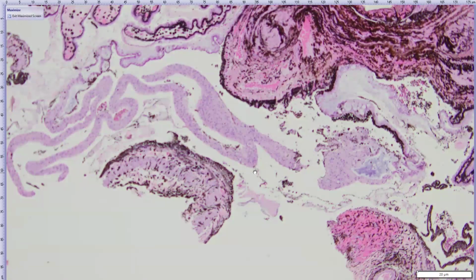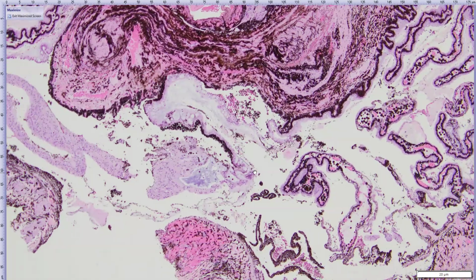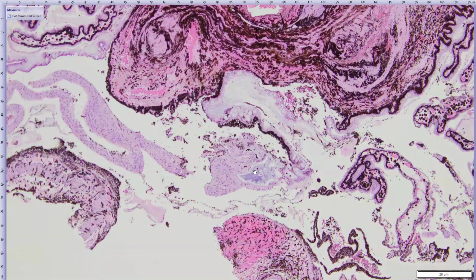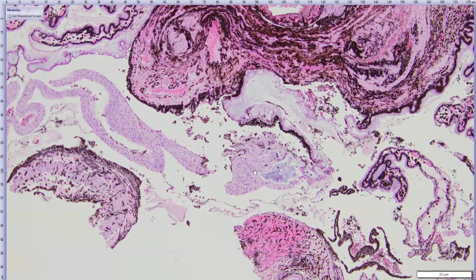This could be due to the glaucoma, but again, remember that they reported bilateral retinal degeneration. And so it can be difficult when we get our samples when there's full thickness retinal atrophy to tell what's maybe glaucoma related versus maybe a primary retinal disease change, such as progressive retinal atrophy, which is PRA, or the sudden acquired retinal degeneration syndrome, or SARDS.